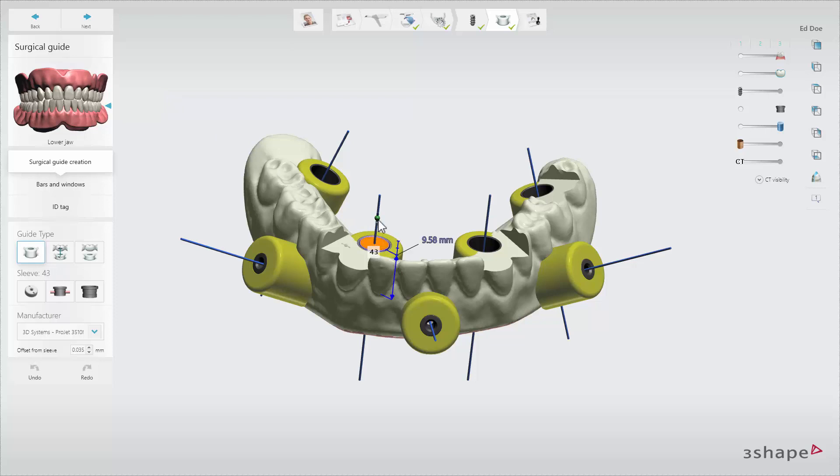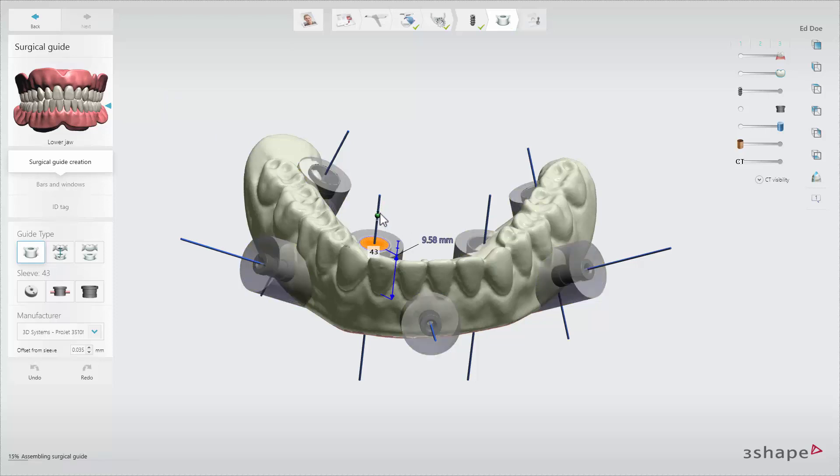You can change the height and diameter of the sleeve support cylinders by dragging the green control handle around the cylinder.